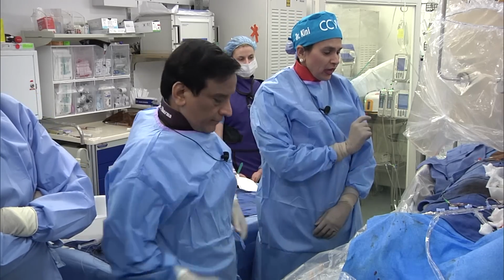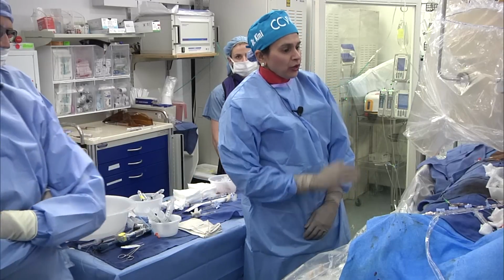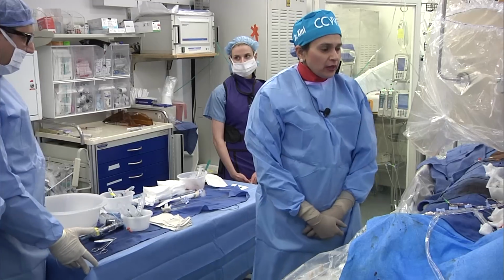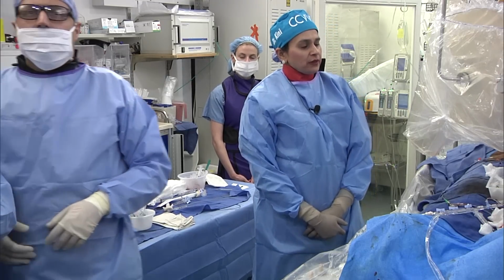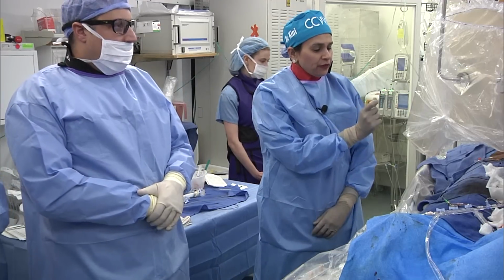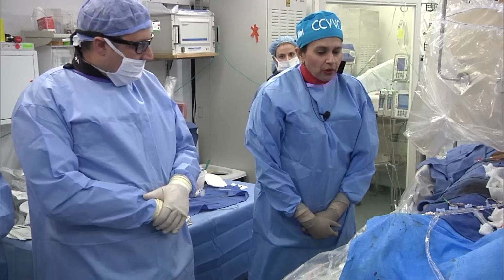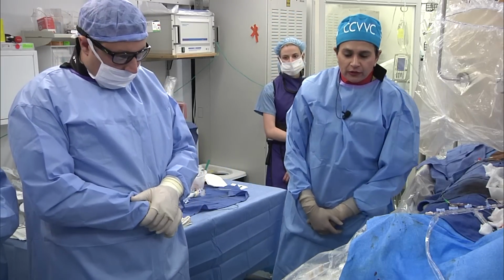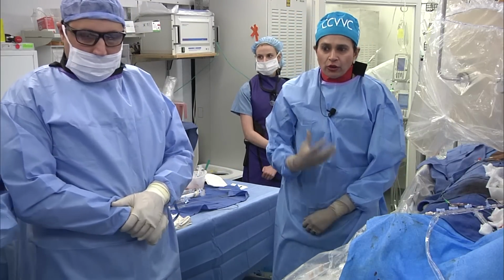So, what we did, you take a 4.0 stent and you deploy at 10 to 12 atmospheres across left main to LAD, and then you take an 8 millimeter 4.5 balloon and go high pressure in the proximal part of the stent, which is the left main. So you know it is well opposed, and that was confirmed by IVUS. POT was also done to make sure that the stent is well expanded at the level of the aneurysm, hoping that the aneurysm will gradually collapse.